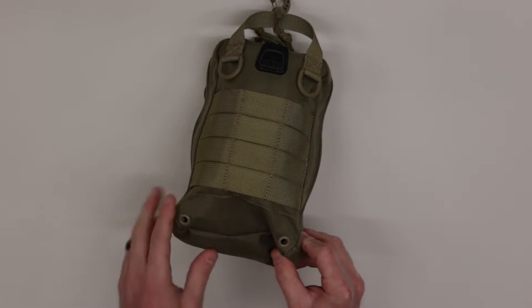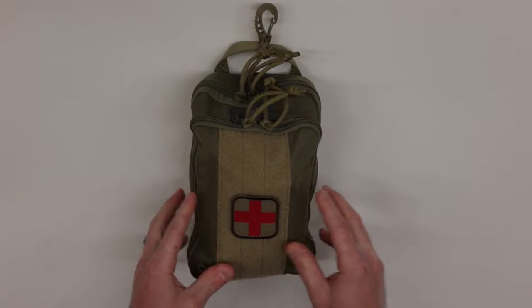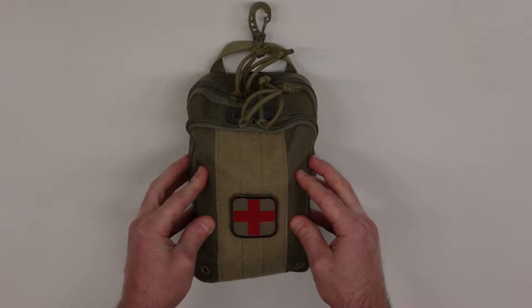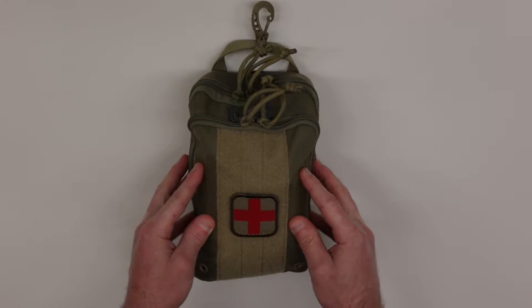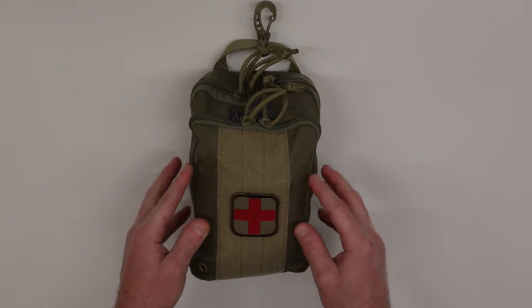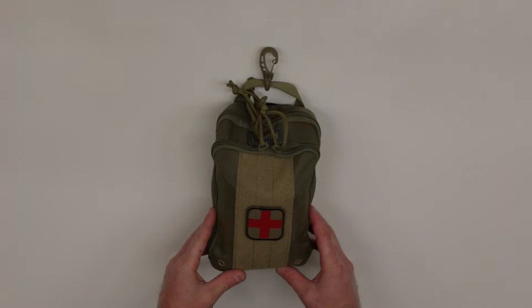Lastly, it has two drain holes at the bottom. Now, this is simply one idea in terms of a pouch to carry your medical supplies in. You can certainly find less expensive options, and worst case you can put all these contents in a Ziploc bag. The pouch itself does not need to be an expensive item.